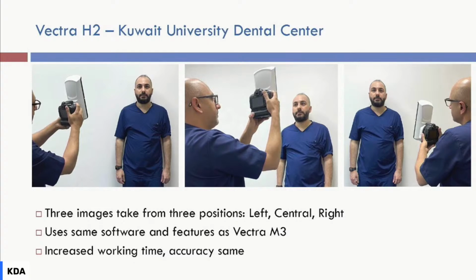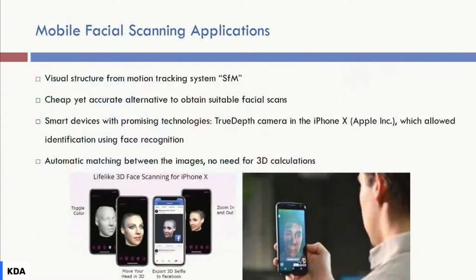It's another machine, but this is a single camera. So with a single camera, you just have to position yourself in 3 positions so that you capture all of those images that we got before. But at this time, you have to move around and take pictures. This is our colleague, Dr. Ali Akbar. Now he's doing his residency in the States. I asked him to take pictures of him, and he allowed us. So the images are taken from different areas, combined together using exactly the same software, same resolution, and then you can go ahead and do the prediction exactly as I did with the original camera.